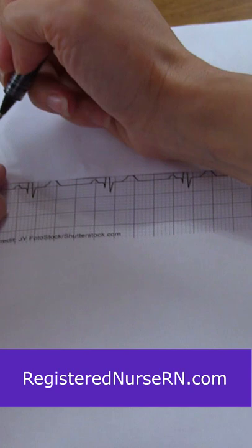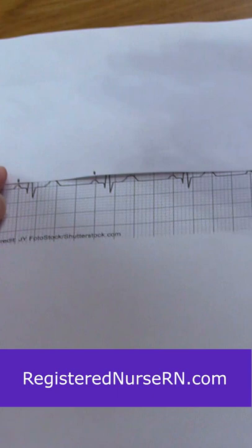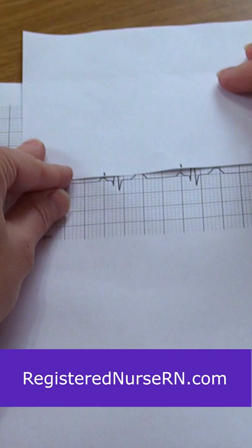Mark the other P wave and then, boom, you have some made-up calipers. Just go down, track it down, see if your P waves are regular.